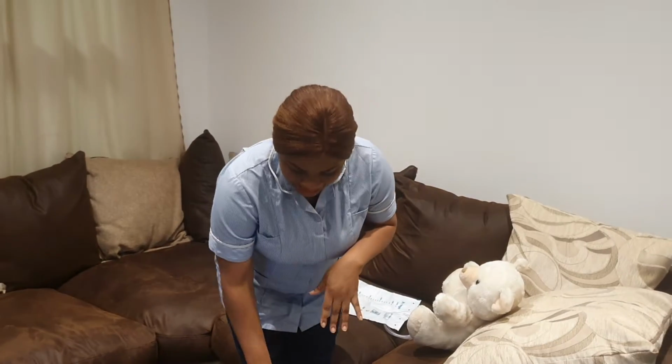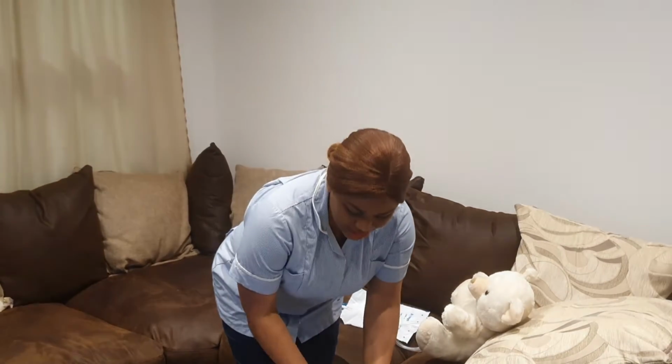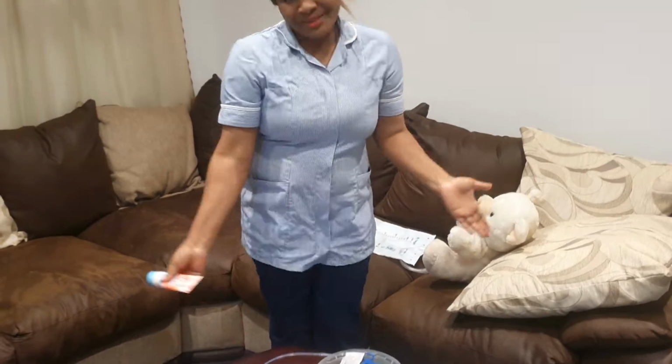Lovely, fantastic. I'll be needing a non-traumatic clamp, guys. And this is my non-traumatic clamp. It's valid and I'm happy to use it. I pop it into the tray. So guys, I've gotten all the equipment I need.